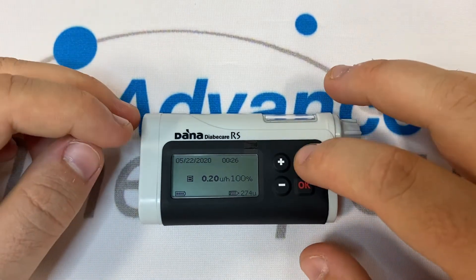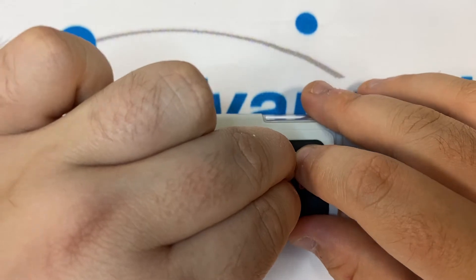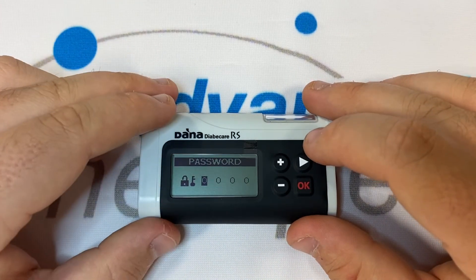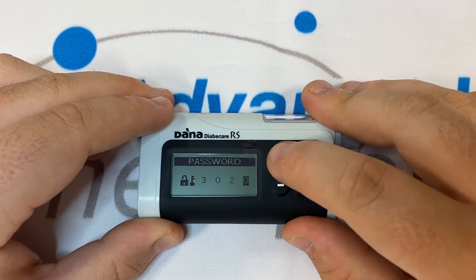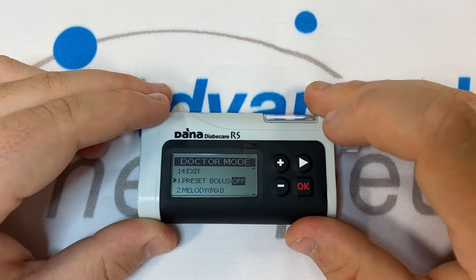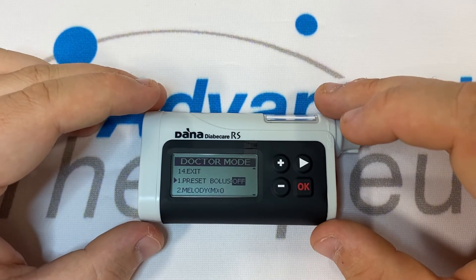To get into doctor mode, we must press and hold the right arrow, then press and hold plus and minus so all three buttons are pressed simultaneously. Release them all simultaneously and a password box should appear. The password is 30 plus the day of manufacture — in my case, 27th. Inside doctor mode, much like user options, we hit a checklist.